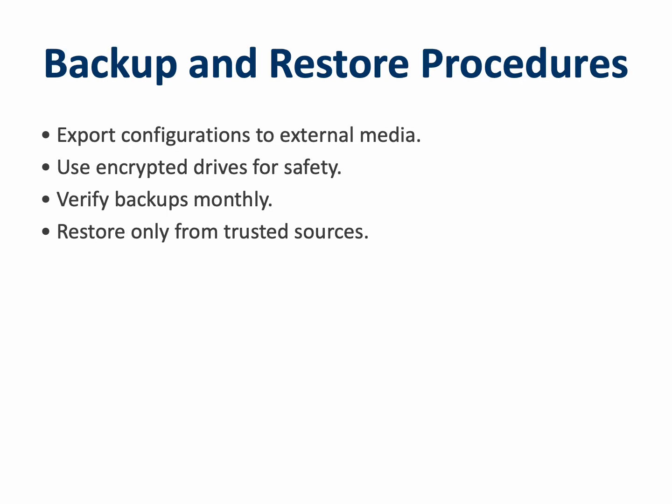Backup procedures are the insurance policy for your configuration. Regularly export setup files and save test sequences to an external or cloud-based location. Always encrypt or secure the storage media to prevent tampering. Check backup integrity monthly by restoring it to a test unit. Never restore from unverified sources, as corrupted configuration files can lead to compliance risks. A disciplined backup and restore routine ensures that even if the analyzer is replaced or reset, your team can resume work immediately without configuration downtime.